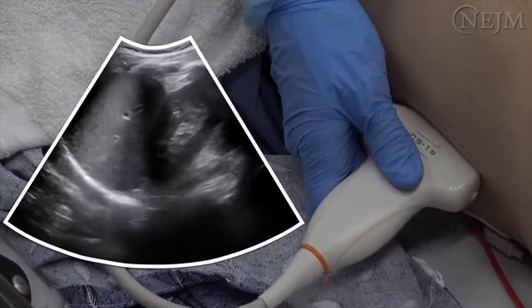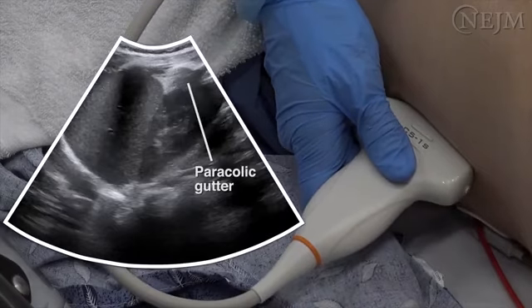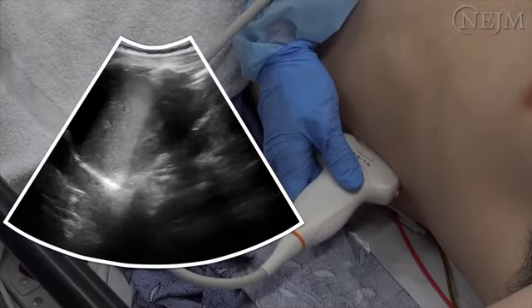Slide the probe caudally to visualize the left paracolic gutter, which is the space between the descending colon and the lateral abdominal wall. Slide the probe in a cephalad direction to visualize the diaphragm, the left subdiaphragmatic space, which is located between the spleen and the diaphragm, and the left inferior portion of the thorax, using the spleen as an acoustic window. Inspect the diaphragm and the left subdiaphragmatic space, which is the location most sensitive for the detection of free fluid in this view.